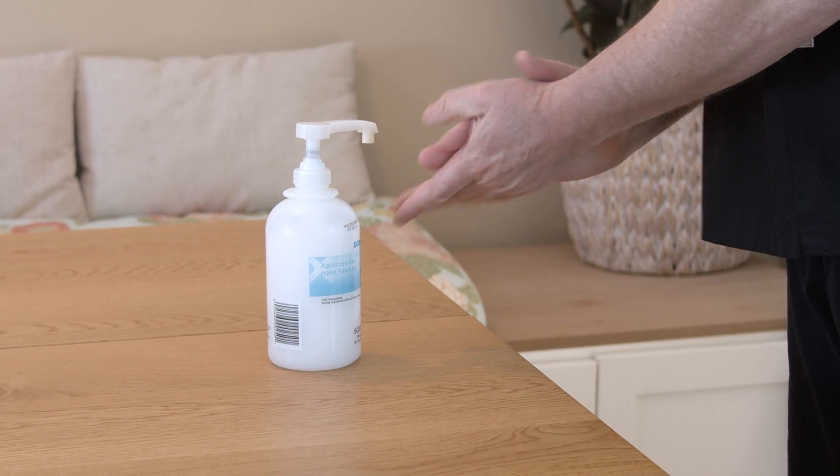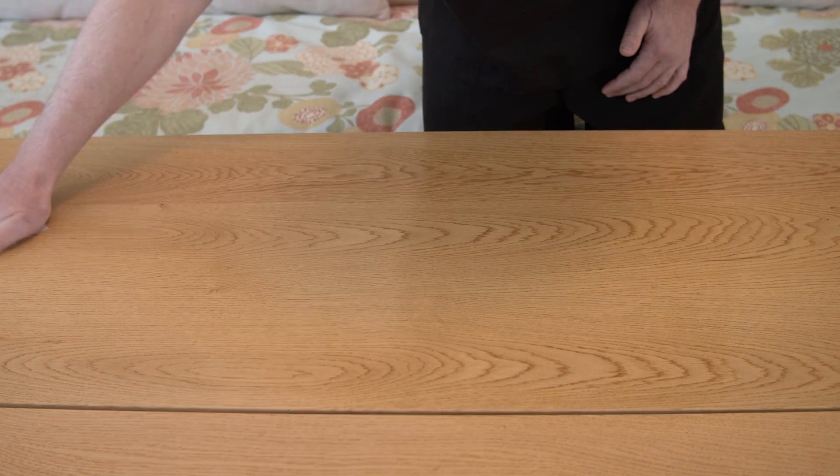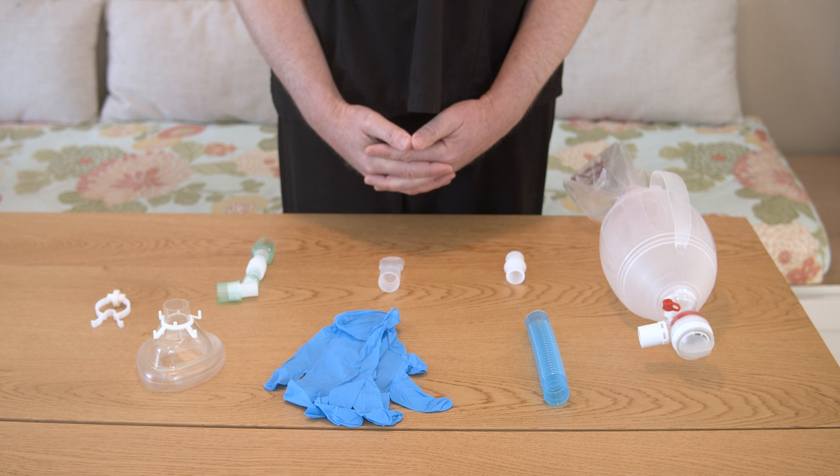To give a treatment, start by cleaning your hands with soap and water or alcohol-based hand gel. Clean your work surface with soap and water or a disinfecting wipe. Gather the equipment and supplies you need.